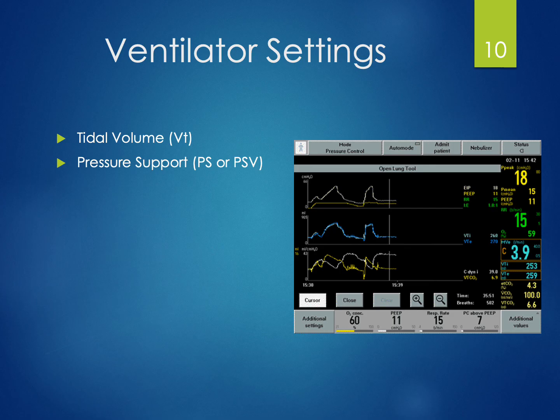So in the basic ventilator modes we'll be discussing in this course, you will only have one or the other. The physician has to choose. Will this patient be on a pressure or a volume mode? And then they begin to select settings. If they've chosen a volume mode, then they will set a volume to a specific setting. So 500 milliliters tidal volume setting, 600 milliliters, 450 milliliters, etc. That's our volume setting. And the same concept applies if we've selected a pressure mode. So now it's time to select a pressure support setting. So will it be 10 centimeters water or 12 centimeters water or 8 centimeters water, etc.